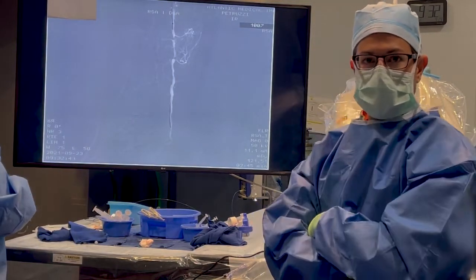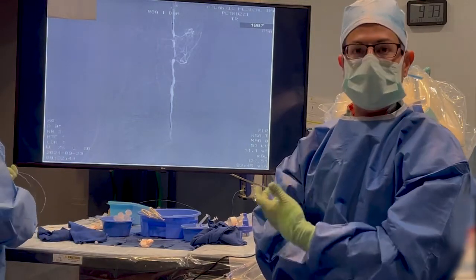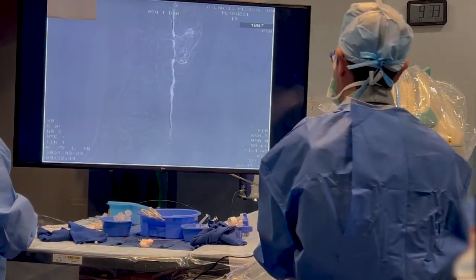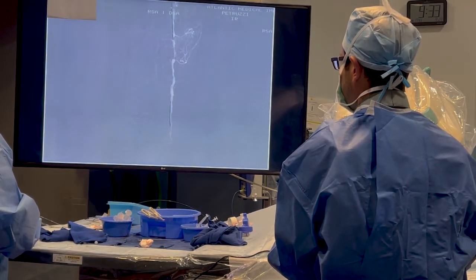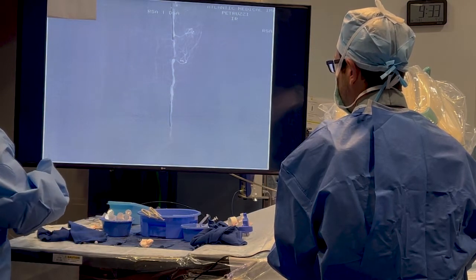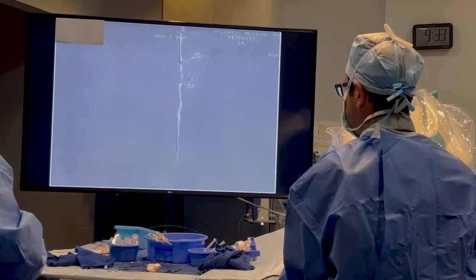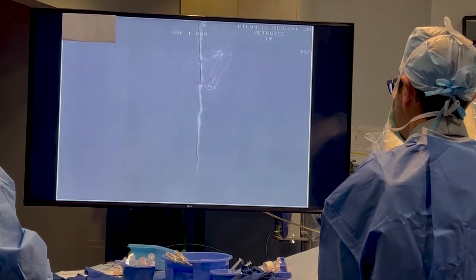it from the artery. And following that, we'll perform what's called an angioplasty, which will open up that blockage once we've removed the plaque and help restore the blood flow. So that's what we're going to do right now, and you'll hear some noise as the device does its job to clean out the artery. And what I'm doing is I'm steering this very carefully and slowly through the blockage and into the other side of it. And you can see this moving. Let me take our time with it and let it do its work.